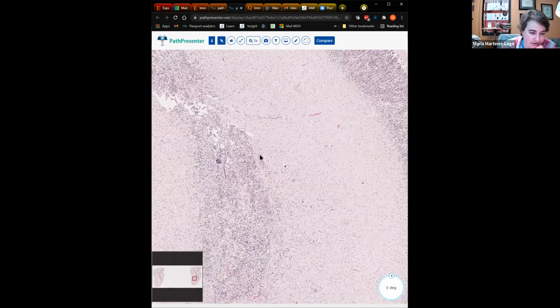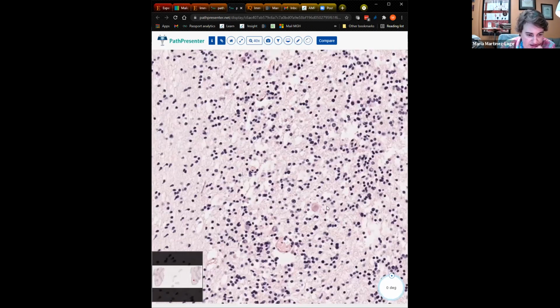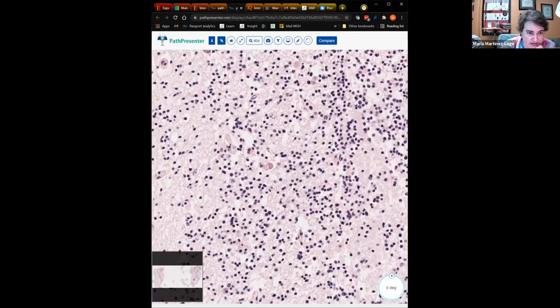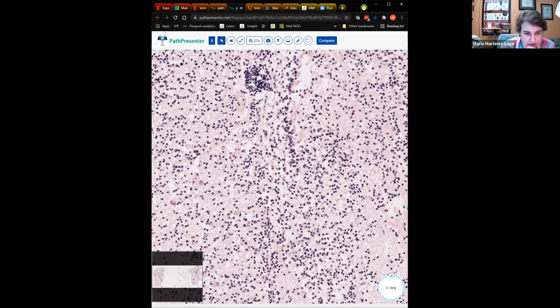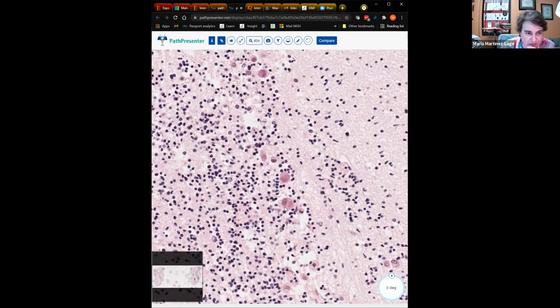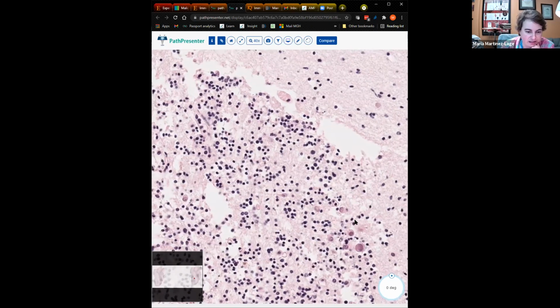For cytomegalovirus, you're going to be looking at inclusions that are similar to the inclusions you see in other areas of the body with cytomegalovirus. So enlarged cells that might have intranuclear or intracytoplasmic inclusions. I think those initial ones are the most classical. Here's this glassy intranuclear inclusion in a very large cell.